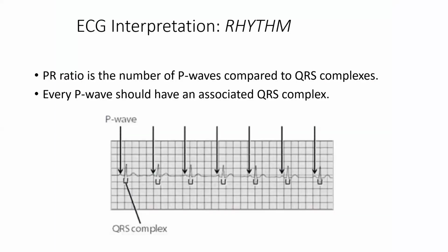And you allow me to move faster because of time. So your ECG interpretation would mean that the distance between one R to the other will be equidistant. So you're able to get a distance between one P wave to the other P wave, or from one R to the other R, and then you'll determine whether your rhythm is regular or irregular. Okay.